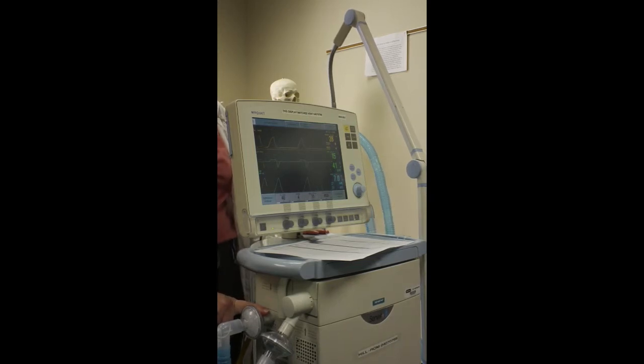Exhaled tidal volume is a direct measurement of how much was actually delivered to the patient. Because if we put 450 here, 450 should go through our inspiratory limb to the patient, come back out through the expiratory limb and back to the ventilator. Does that make sense so far? Because exhaled, people think, oh, that's what the patient exhaled. It's actually a direct measurement of what the ventilator delivered. Because if we had 450 here, we should get 450 back.